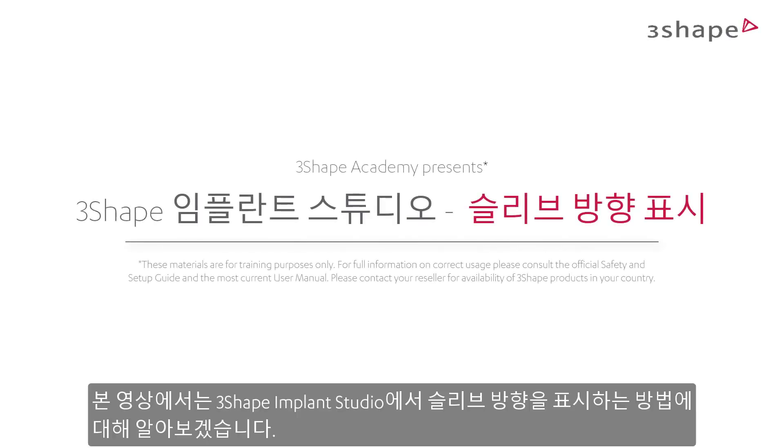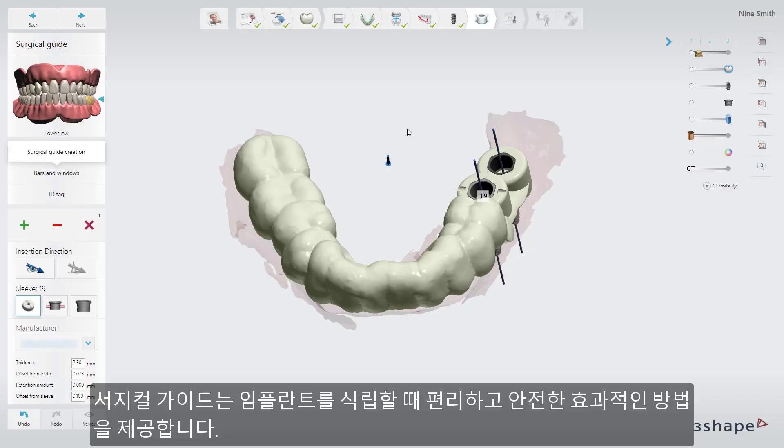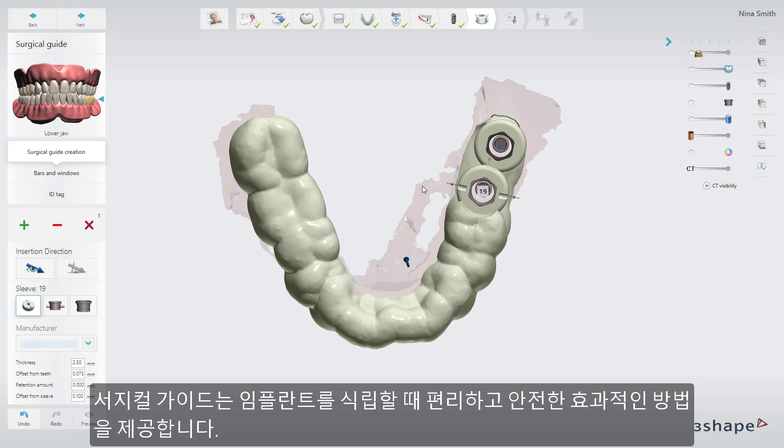In this video you will learn how to use sleeve orientation marks in 3Shape Implant Studio. Placing implants guided is generally recognized as a convenient, safe and effective alternative when the surgical procedure allows for guided surgery.